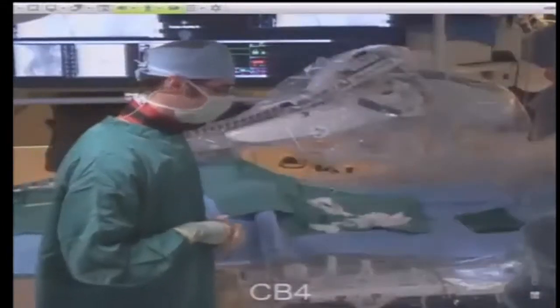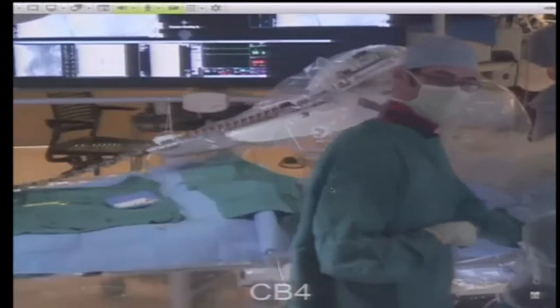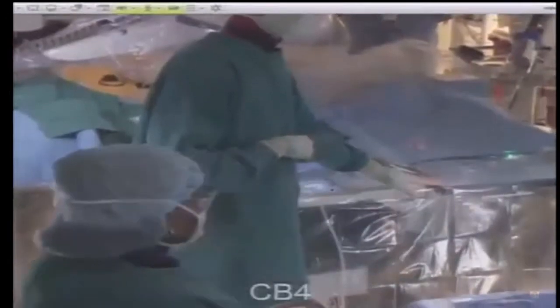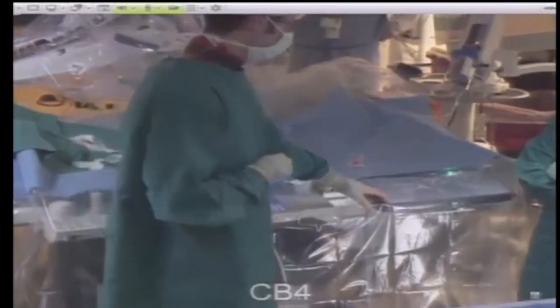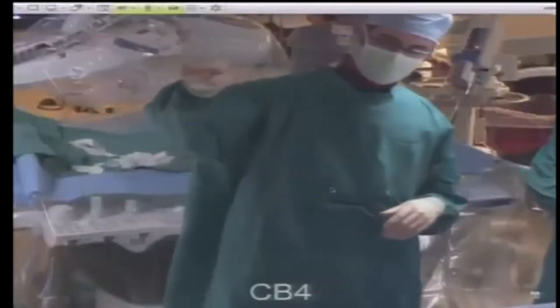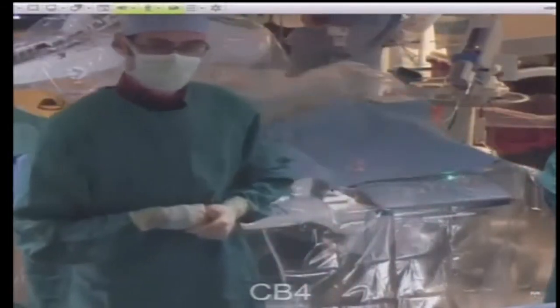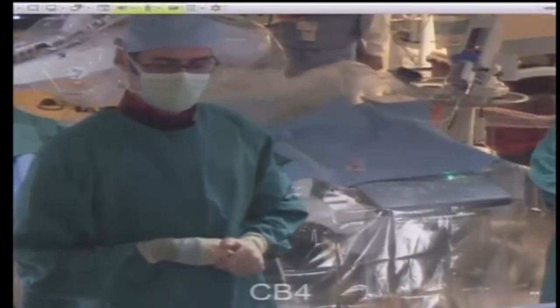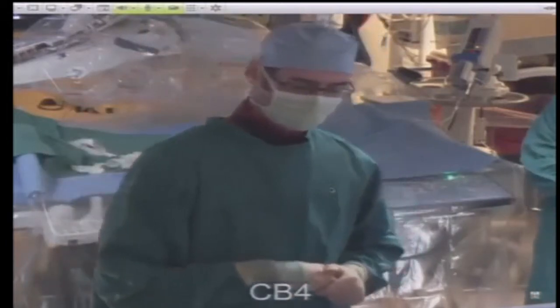There are two ways of guiding the system. This is a bedside pendant, and everything that you can do here you can also do at the console where we're going to be guiding the catheter from — which is remote to the patient, and allows us to be out of the X-ray field, giving us a little bit of protection from all the radiation we get every day.